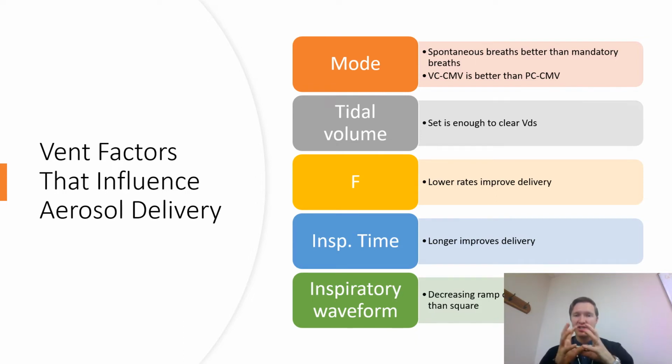So with that even gas distribution, you're going to have much better particle deposition, much better distribution, much more even application to your lungs. So that's not saying switch a patient to spontaneous mode, what if they're on paralytics? What if they're really, really sick, right? No, this is just saying, hey, in the world's most optimal place, spontaneous breathing counts, and it does. So spontaneous breathing is, believe it or not, actually better than mandatory breaths, because the patient is pulling that medication in, and it's allowing for more even distribution compared to positive pressure, which just forces it down the path of least resistance.